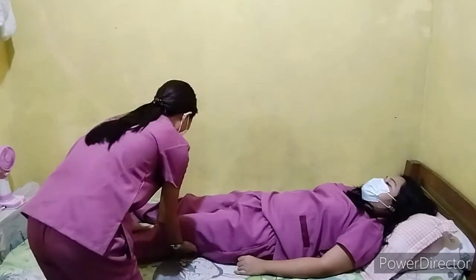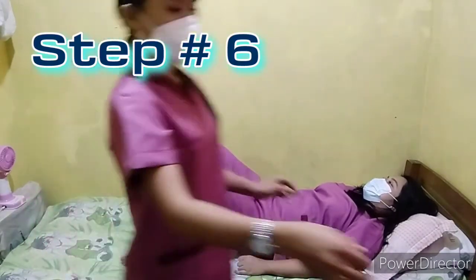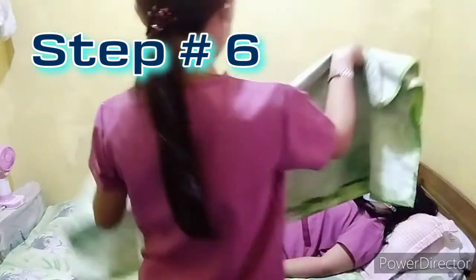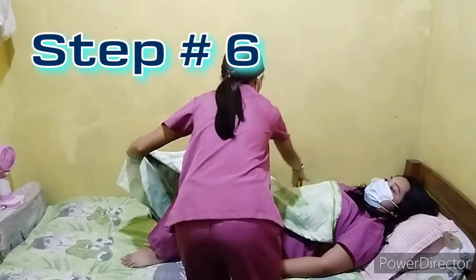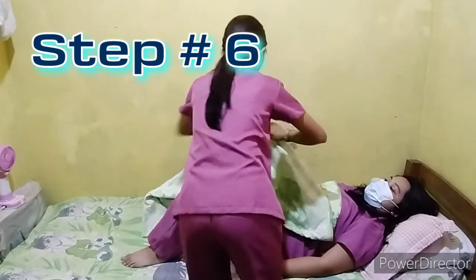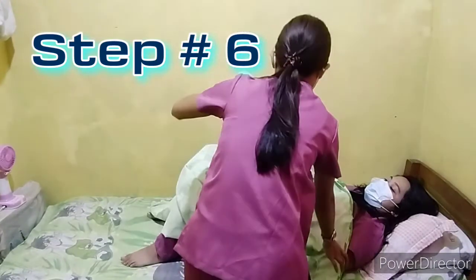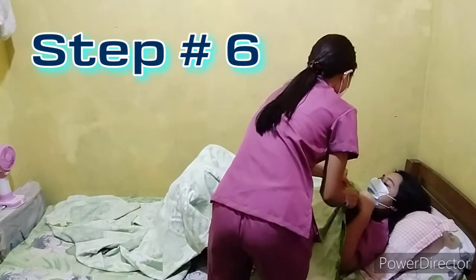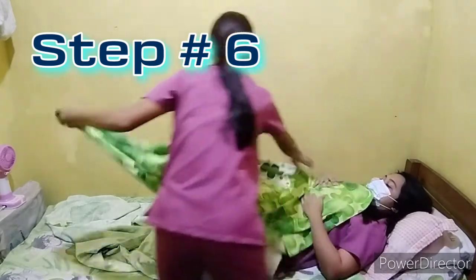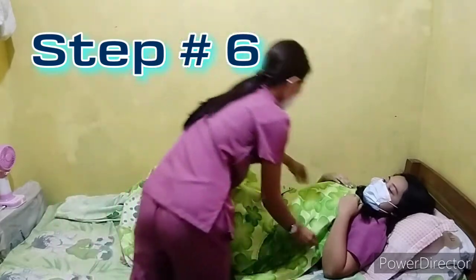And for step number 5, place the patient in dorsal recumbent position, and the affected body area should be cleansed well and dried thoroughly. This is to provide full exposure of the female genitalia. Drape the patient. To drape the patient in dorsal recumbent position, the following steps should be followed. Draping prevents unnecessary exposure of body parts and maintains the patient's warmth and comfort during the procedure.